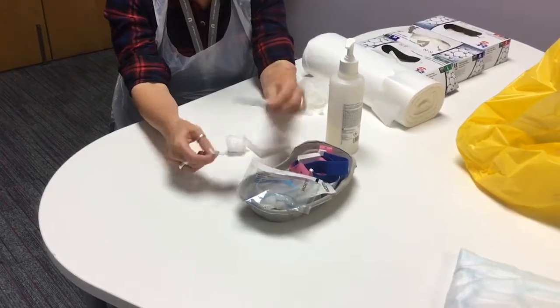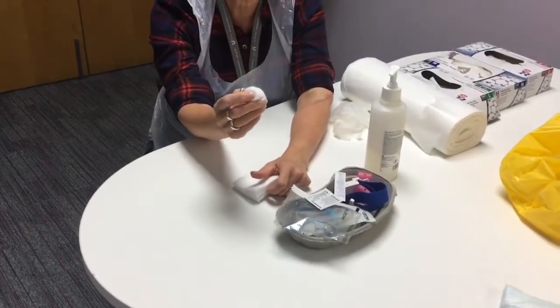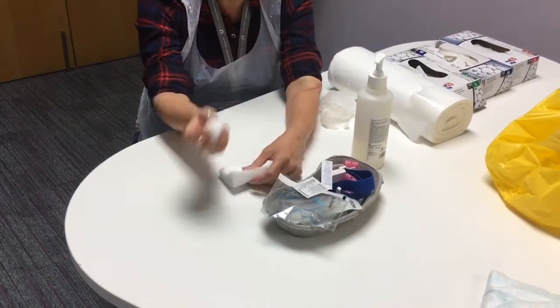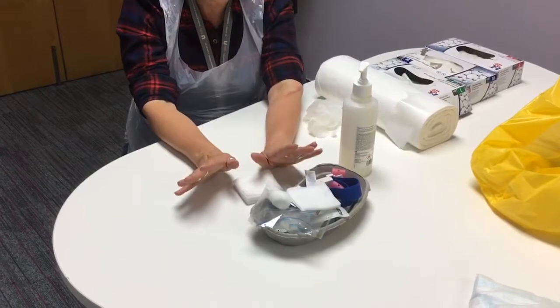Afterwards, when you remove the needle, you will need something just to press against the wound to stop bleeding. You can use cotton wool — that's fine — or you can use gauze, just a little bit. So that's all the equipment that you require.